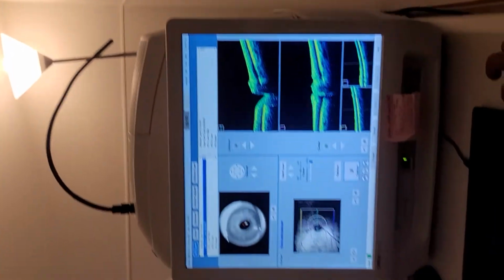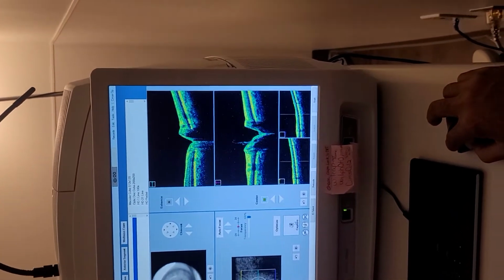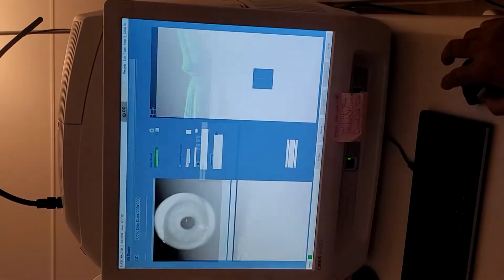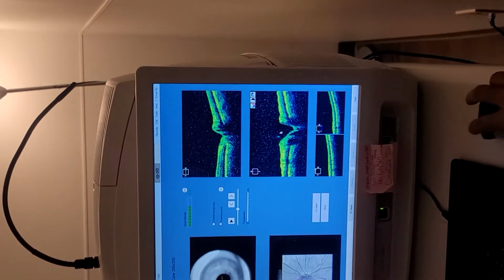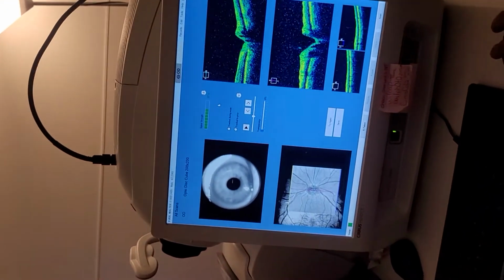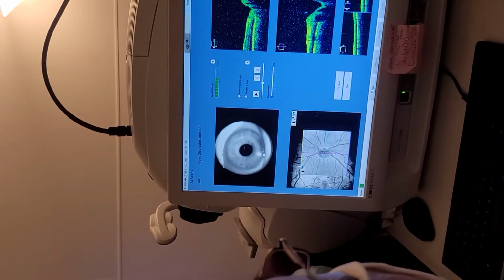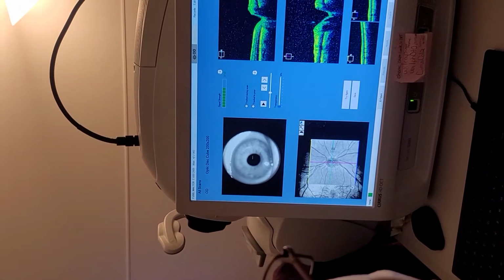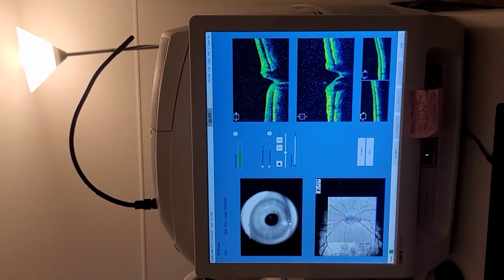Get that back over there, see, okay. Now, did you see how much clearer it is? Wow, it's much better. Okay, now, but you wanna change this, right? You can change. So see the top image? Take your aqua blue line and bring it down a little bit more.